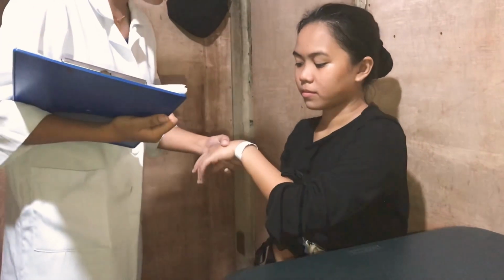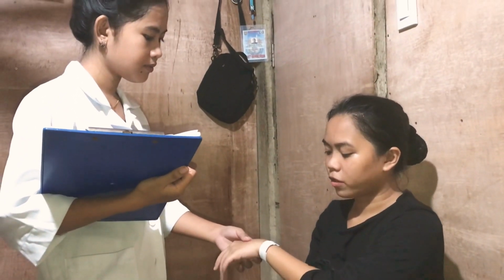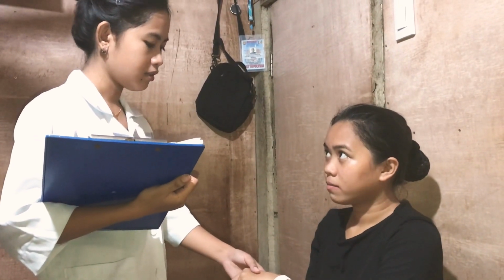What's your name and when is your birthday, ma'am? I'm Respiratory Talagan. I was born on February 2, 2001. Okay, thank you, ma'am. And today, I'm going to demonstrate the axillary method and ensure the patient's privacy and help her into a sitting position. And it is necessary to take a temperature for you to know your body temperature and help detect disease early and help you know that you're okay.